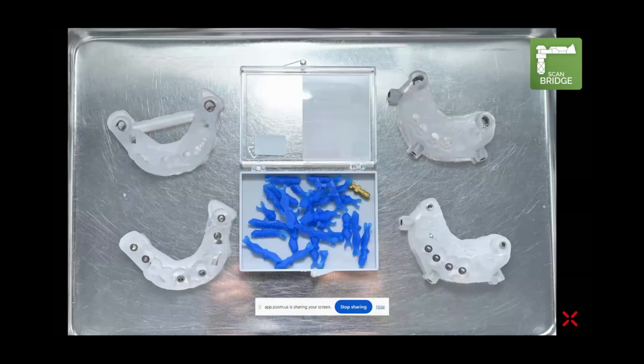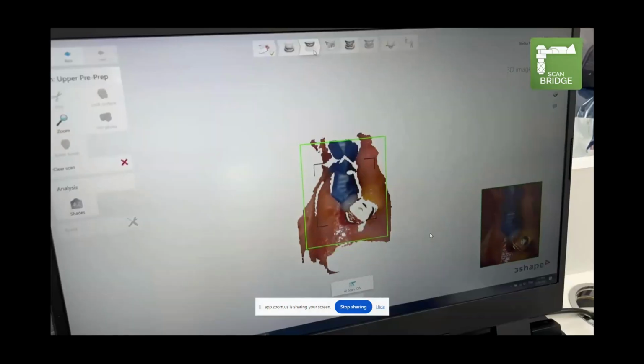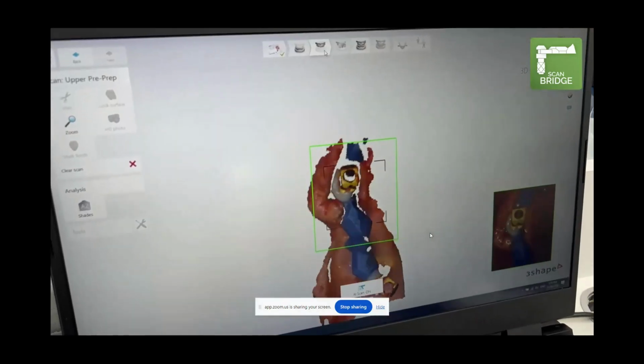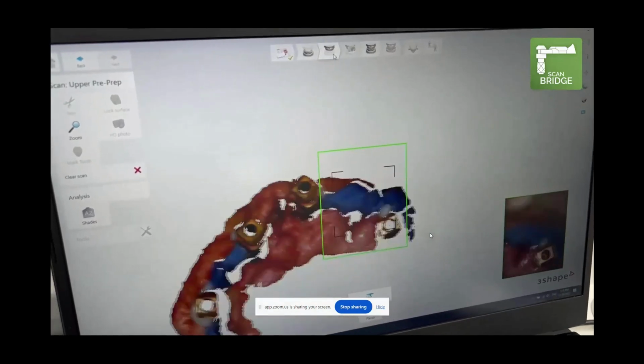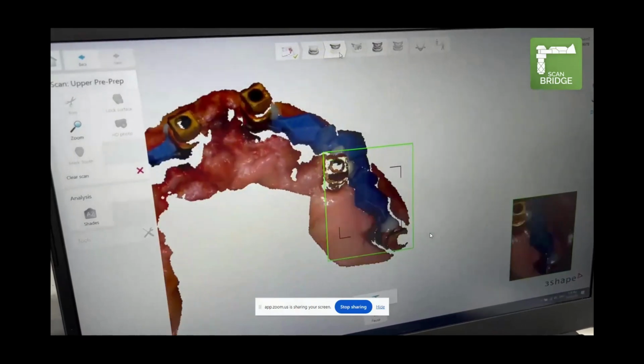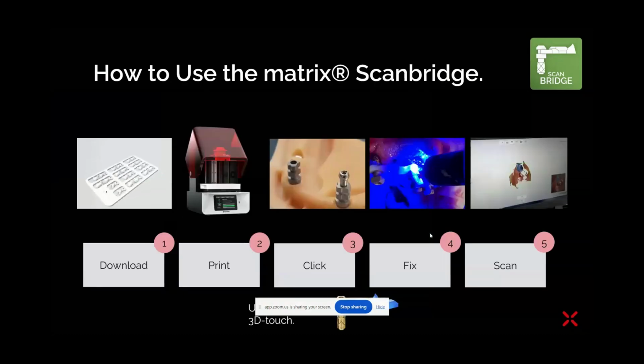So this is what the scan bridges look like. You put the scan bodies inside the implants, and you connect them with the scan bridge, and then you put some composite to stabilize them, and you do an IOS scan, just like Chris was showing. Some people even take an impression of that and scan that impression. So it works quite well even if you don't have photogrammetry. So this is how we did it for our patient here in the mandible, because remember, I did not have photogrammetry for this case from the very first case that I showed you.